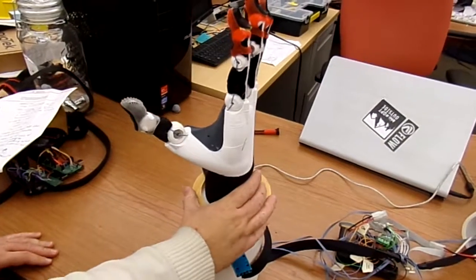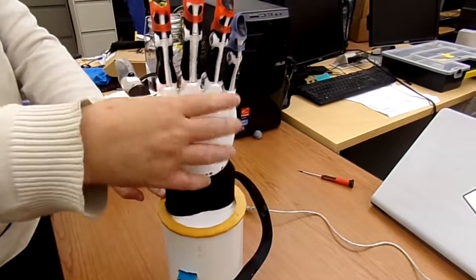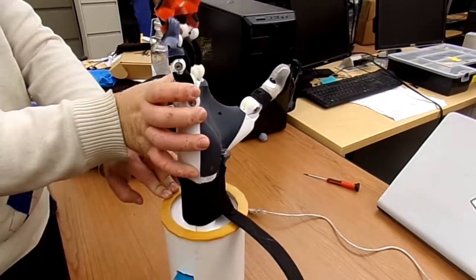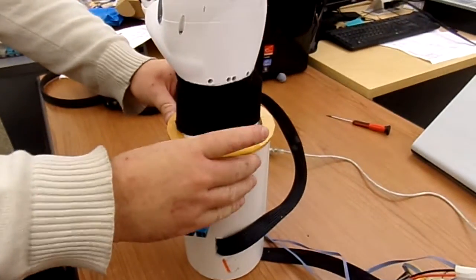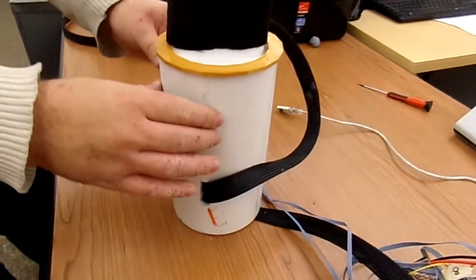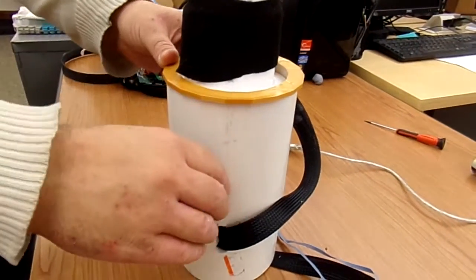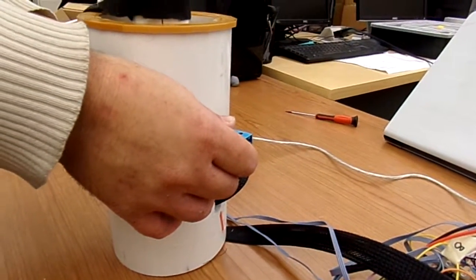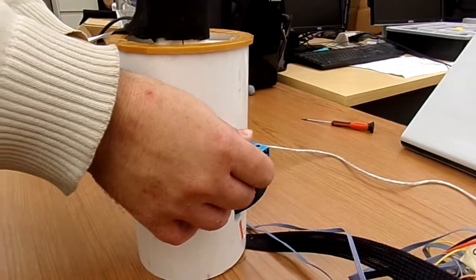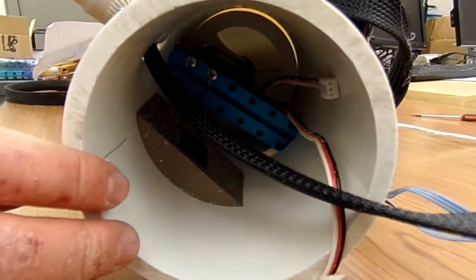At the base of the hand, we have a wrist, which allows for pronation and supination up to 180 degrees. It is held in place by a retainer ring and extends below the base with ball bearings to hold it laterally while allowing for free rotation. It is all mounted to an aluminum block that holds everything in place and ensures that it doesn't move. At the base, we have an area for the electronics to be held.